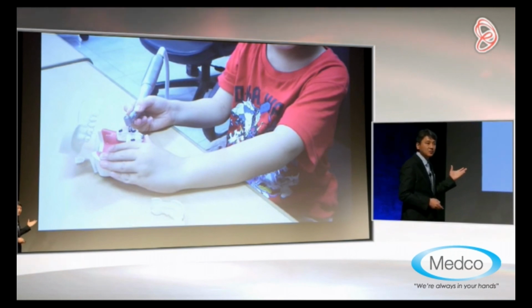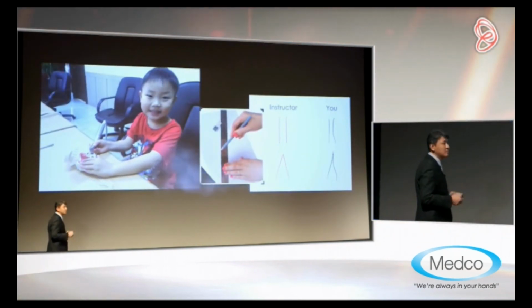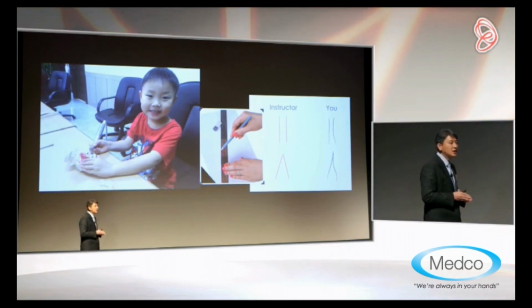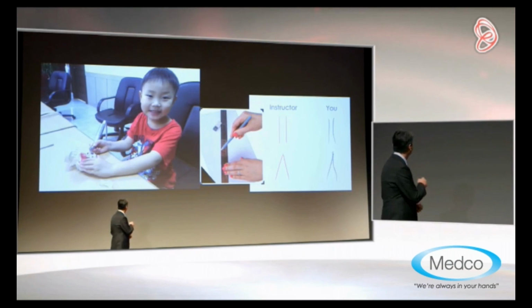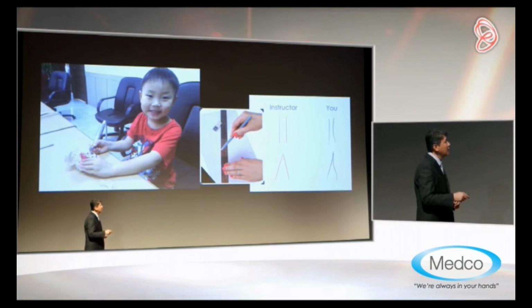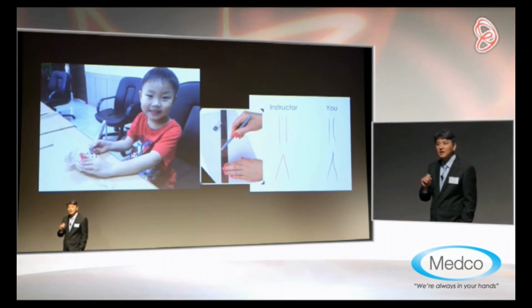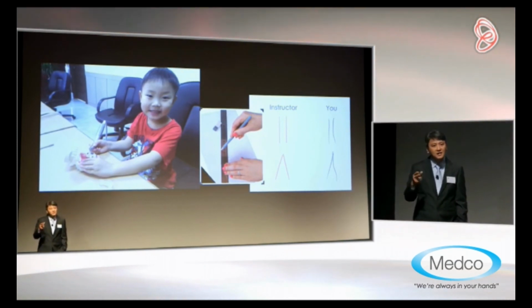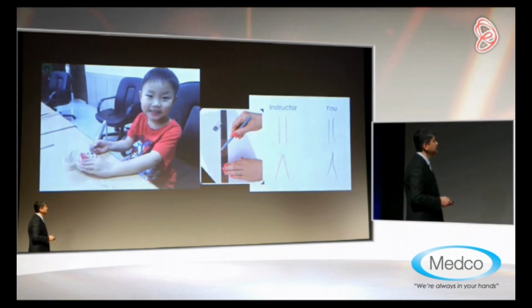Even my son, who was 5 years old at that time, is able to place implants very, very nicely because all you have to do is follow the osteotomy set by the guide. If you were to freehand, it's very difficult to draw a nice straight line. But if you have a ruler, anybody can draw 2 perfect parallel lines.